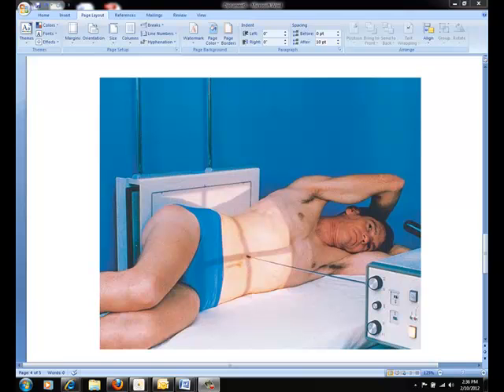Be sure to place the patient's arms above the level of the diaphragm so that they are not projected over any abdominal contents. You also will want to flex the patient's knees slightly to provide stabilization. Using a horizontal beam, direct the central ray perpendicular 2 inches above the iliac crest. Once again, be sure to get suspended respiration after expiration.